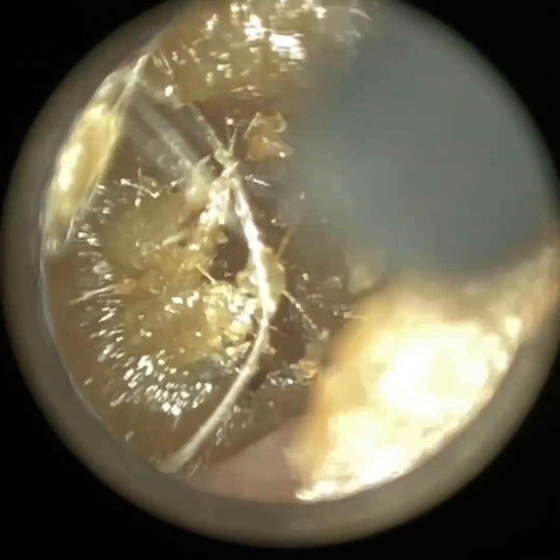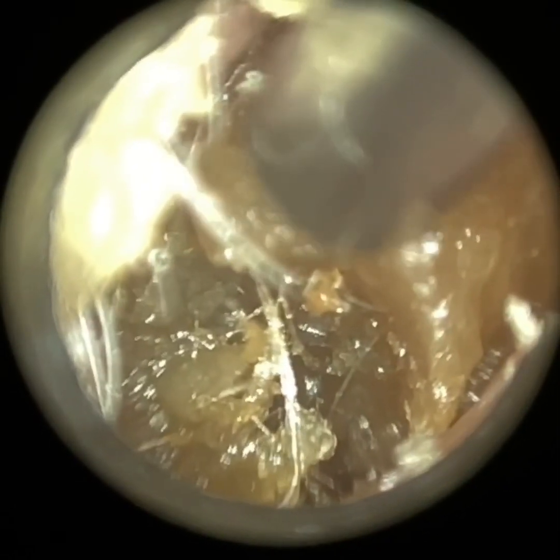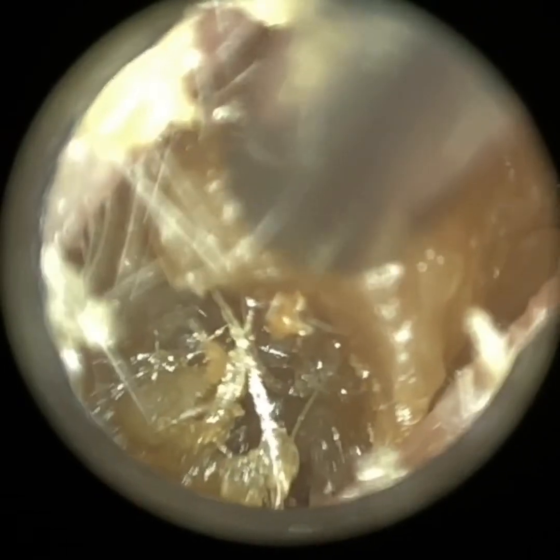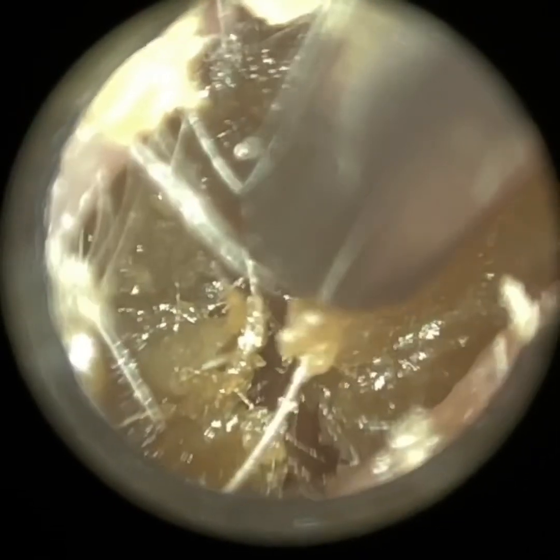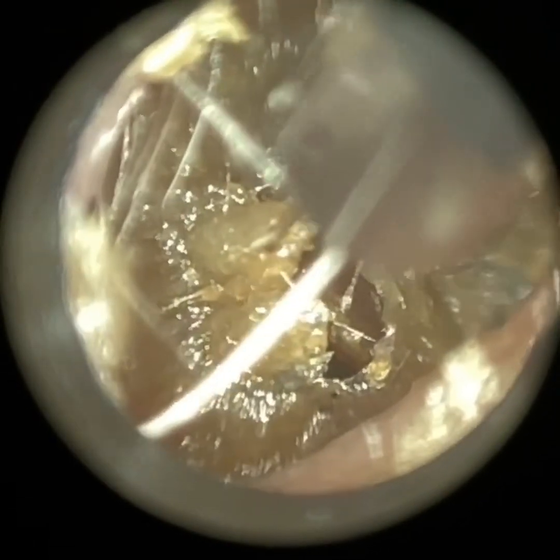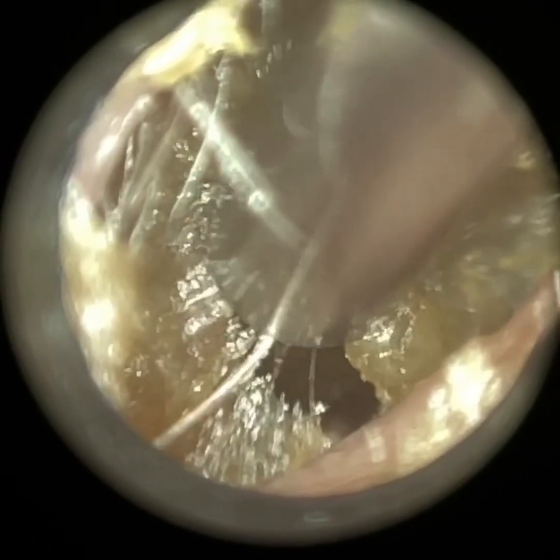I'm just entering with the medium-sized Waxcape speculum, just dilating open up the ear. The reality with this patient is that if you wanted to visualise the anterior aspects of the eardrum, you would need to use an endoscope. With the Waxscope, an ENT microscope, or a traditional otoscope, you're just not able to view the front section of the ear canal. After the procedure I did look with an endoscope and it was all clear and fine — no abnormalities detected.